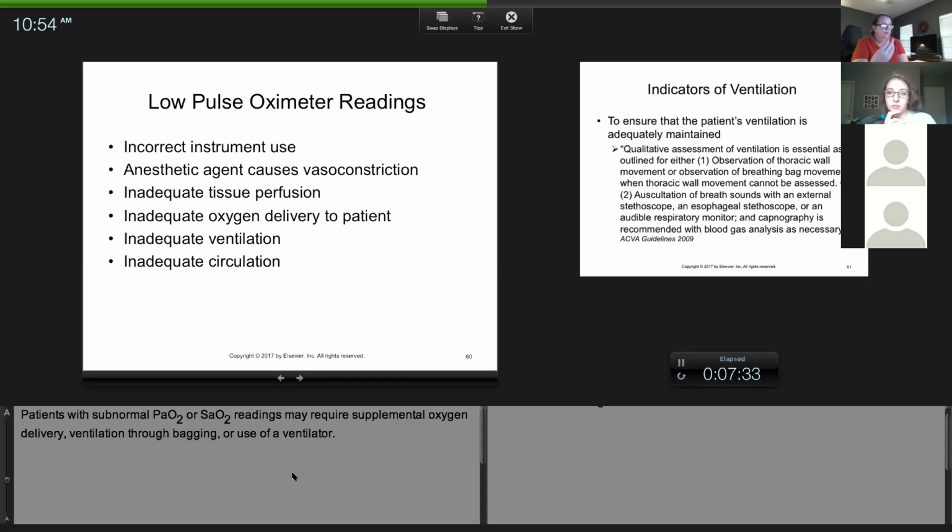Okay. Let me give you an example, and we're going to end on this slide, but tomorrow I'm going to show you the troubleshooting chart. Think of it this way. I had a dog. I was first starting out before I went to school, and I was trained on what's normal, and the pulse ox was reading like 90, 87, and I was freaking out.